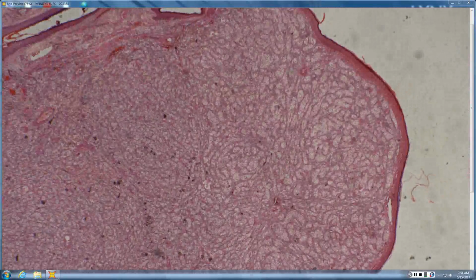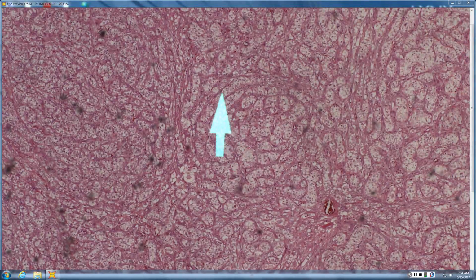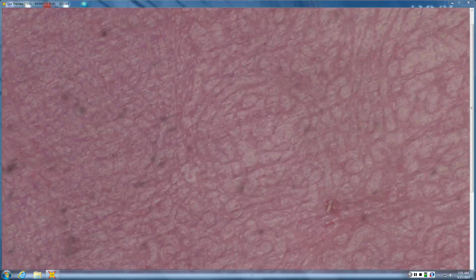Looks like clear cell change. Looks like renal cell. So it looks like renal. So that's one that is fairly recognizable, and you really should be able to recognize it and then get confirmatory tests. So the elongated clear tubules, the chicken wire blood vessels, and then by confirmation CD10, RCC, a whole host of possible markers that you could use.